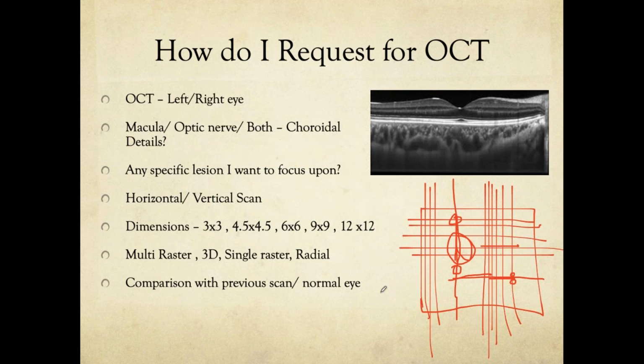This is very important, because what happens is, basically, if you consider this as an optic nerve, and you want to scan a lesion that is this huge, you just send for an OCT and the person just makes a scan that is 3x3. It makes no sense. This is already a damaged tissue. What do you want to do further, looking at a damaged tissue?